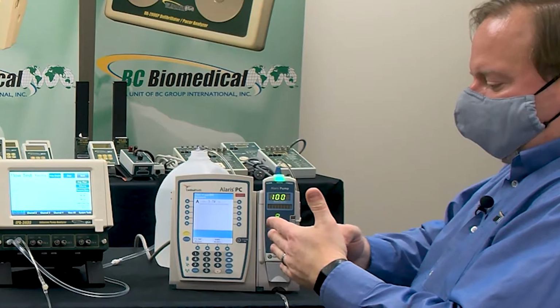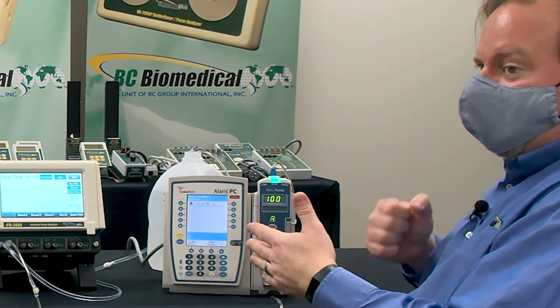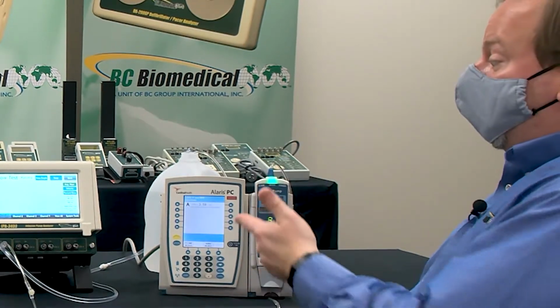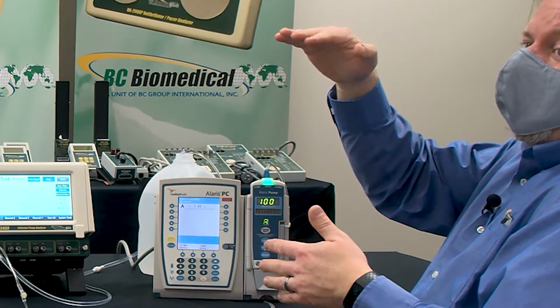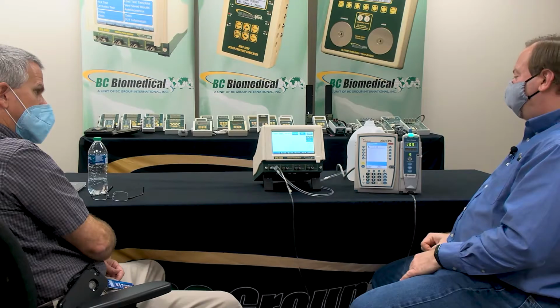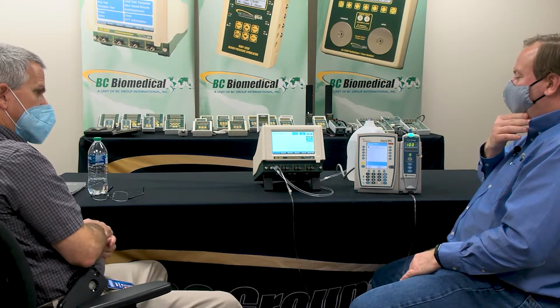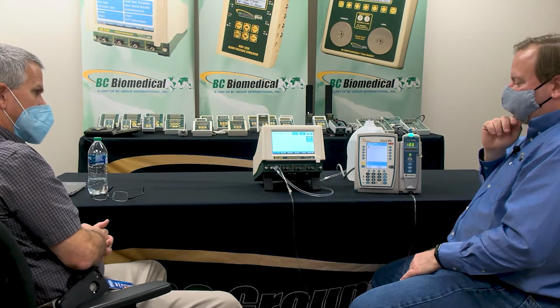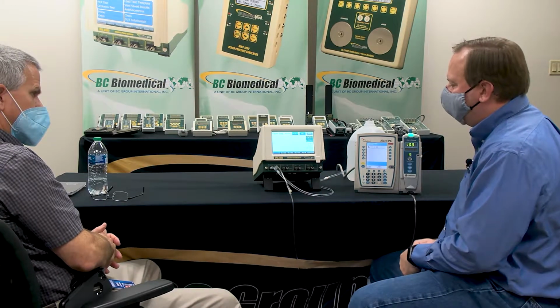Now some of them inside have a piston, and it has to retract and then push, and you'll get that. So in order for it to get the average flow, the instantaneous flow has to be pretty high, because it takes a period of time to pull it back and then push again. This is one of the better designs. It's a really good pump in that regard, as far as its continuous flow rate, or average flow rate. So that's a great question.